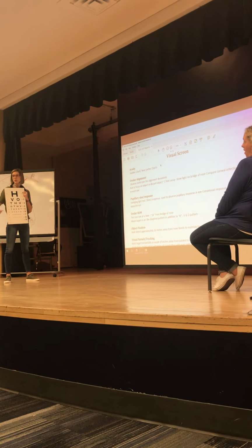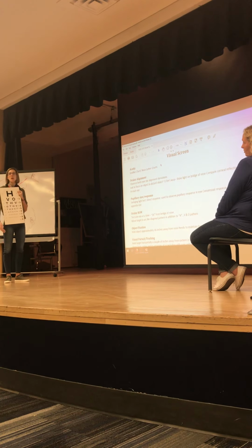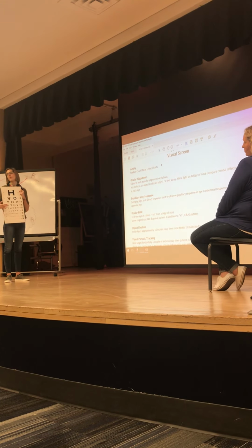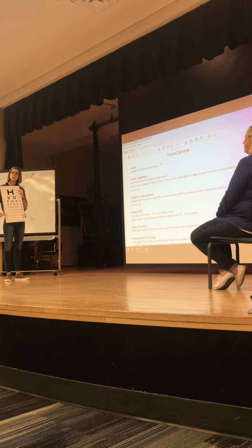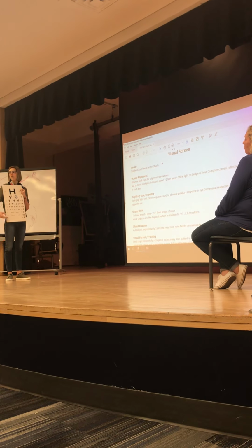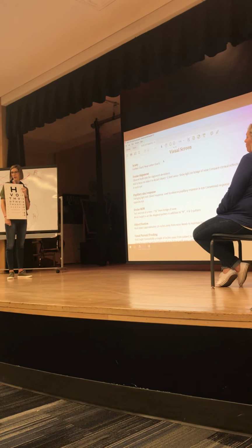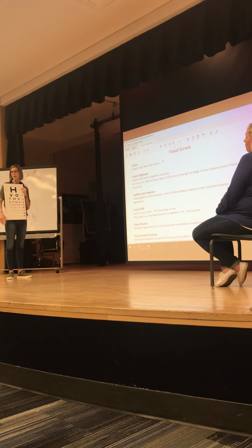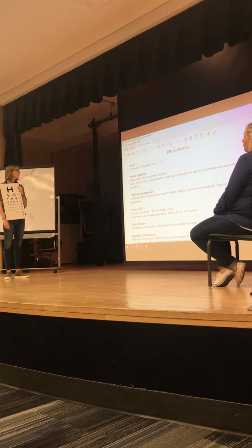A lot of times you saw me use my finger. A lot of times in my documentation I write that I give a finger cue, but it helps to speed up the pace of the assessment. I like starting with the lowest they can read, instead of her starting from up here. Look at how much time that could have wasted for me. So you start with where they feel most comfortable and then you push past that to see how low they can go or how accurate they can be. So that's for acuity.